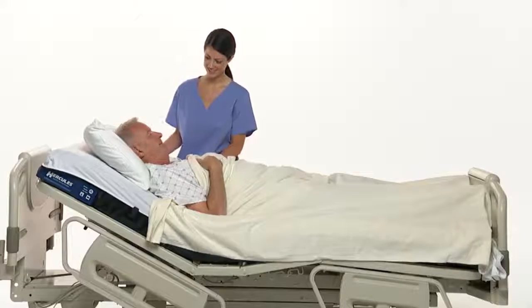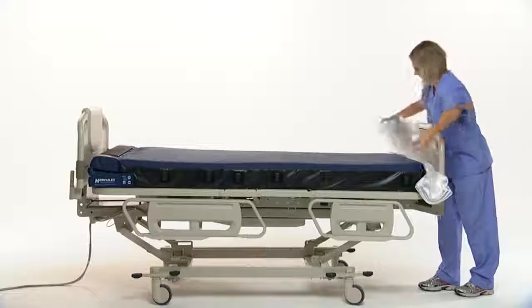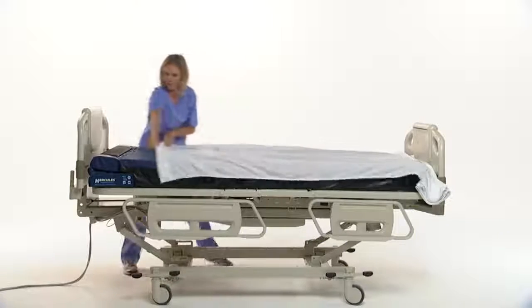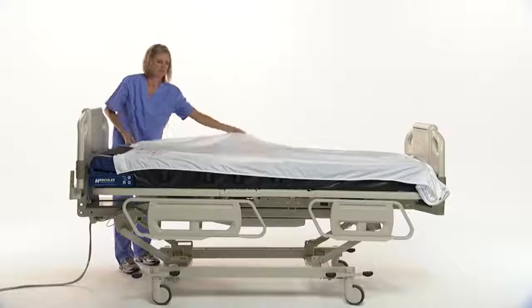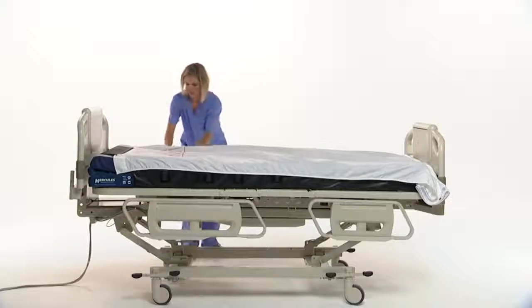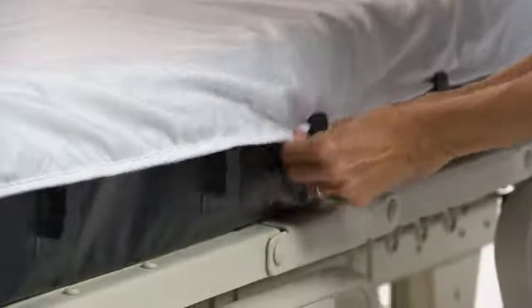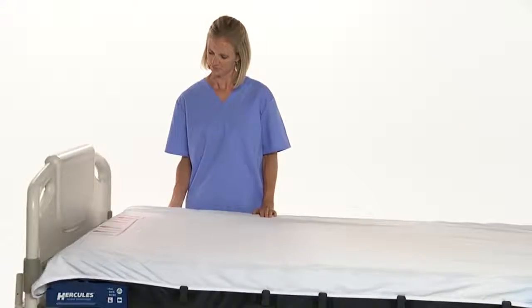Your patients will appreciate being repositioned with Hercules. A specially designed sheet, whose length allows for up to 10 repositionings, is secured to the drive unit. Clips along the sides of the sleep surface help ensure the sheet stays properly aligned and help prevent the sheet from wrinkling. Once the sheet is advanced into the drive unit, the system is ready for use.